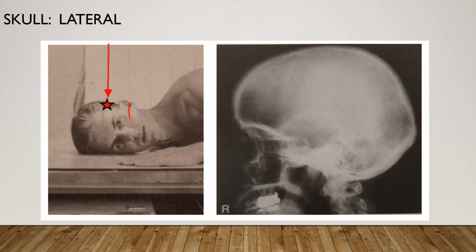After you x-ray the patient for the right lateral, you're going to bring the patient's left arm down, right hand up, turn and put their left ear up against the table, and you're going to position the patient for the opposite lateral.